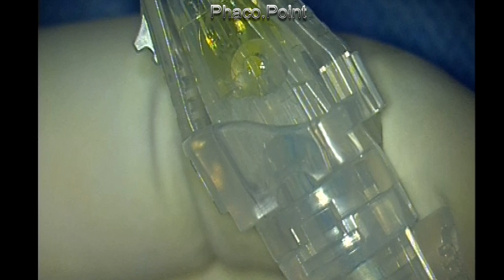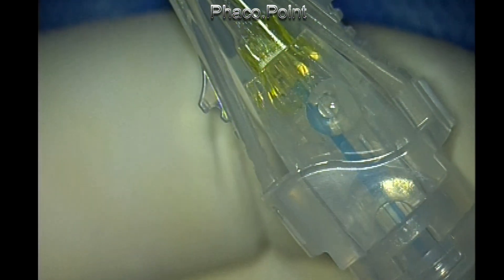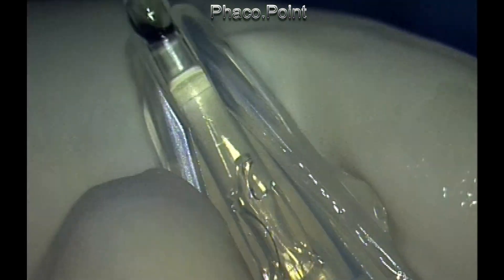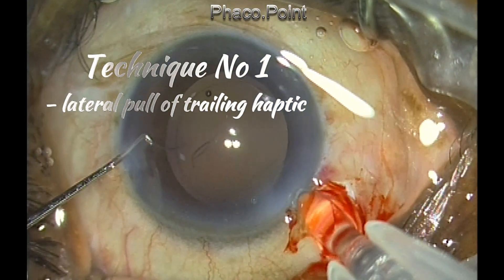Once the intraocular lens has been positioned and loaded into the nozzle, there is one more attachment in this injector system: a small retractable flange seen near the nozzle tip. This will enable us to do either a wound-assisted injection or an in-the-bag injection.